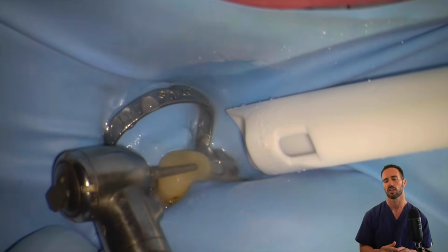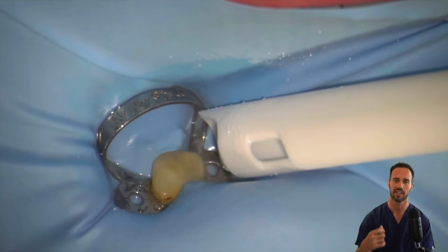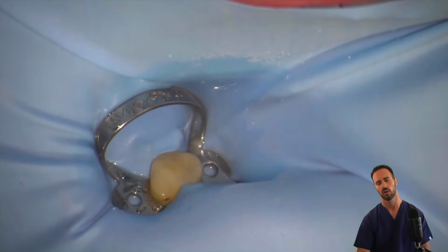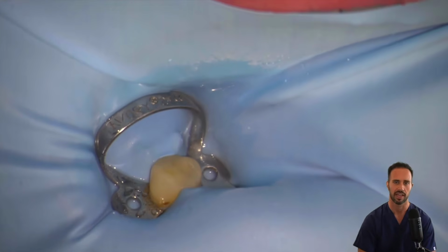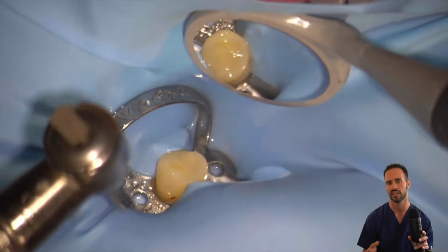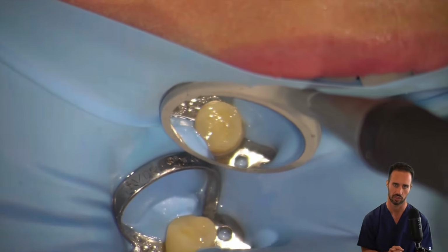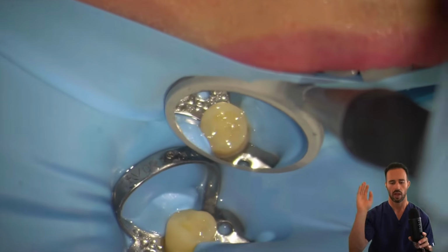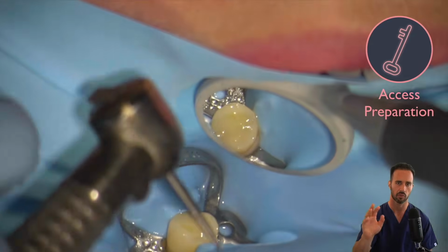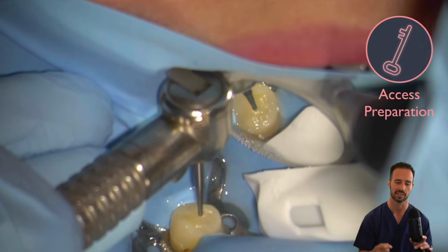Also, the reducing of the occlusion is going to lower oftentimes the post-operative pain that the patient experiences. All right, so you don't want to get that call on a Saturday night with a patient complaining that they have some pain to chewing, when you could have very easily managed that with some lowering of the occlusion. All right, so after anesthesia delivery, we go ahead and lower the occlusion after rubber dam isolation, and now we're going to start with our access preparation.